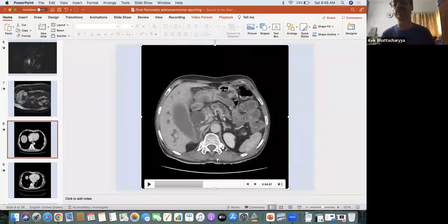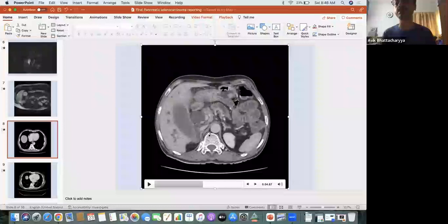Better if you sit with a radiologist at the console of the CT scan and MRI, scroll yourself with the mouse in your hand and see the structures yourself. This is very important. As I told sir, you can come to CMRI anytime for this type of discussion. I would love to. These are all our institutional cases, and I can show you anytime. But don't look at the plates, because the plate would not give you a three-dimensional idea, so something will always be missing.